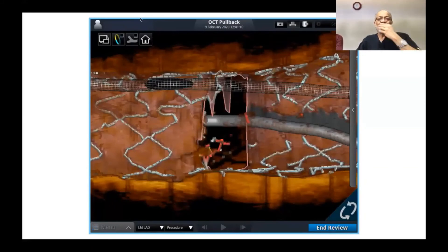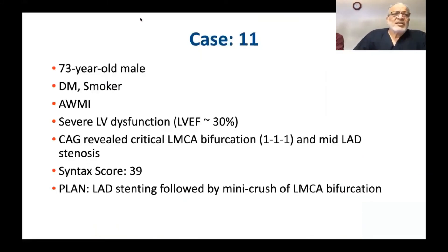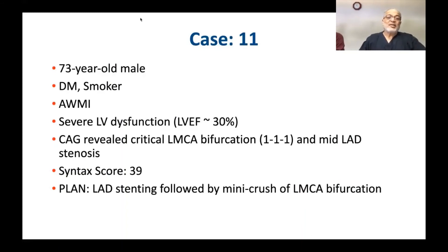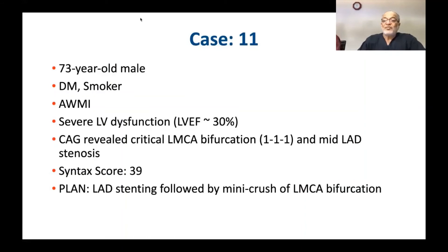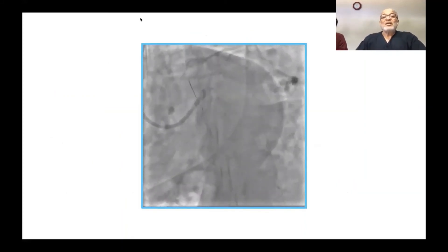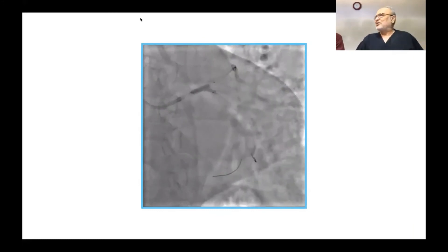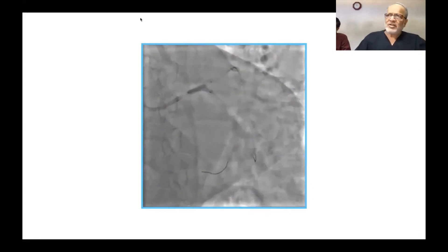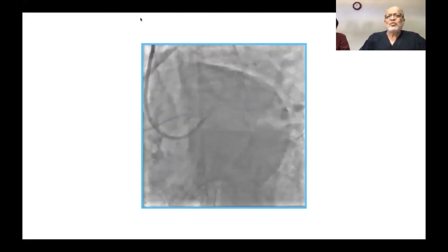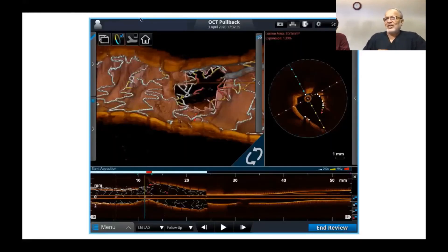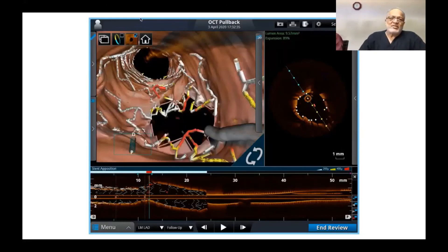A 73-year-old diabetic smoker with ongoing anterior wall MI and severe LV dysfunction, LMCA bifurcation Medina 111 plus mid-LAD stenosis, high syntax score. Plan: LAD stenting followed by mini crush of LMCA bifurcation followed by final kissing balloon. Because it was an acute MI situation with ongoing anterior wall involvement, we did not insist on distal crossing. Result was reasonably good but OCT showed link-connecting carina, proximal crossing, and good amount of crowding — acceptable in that emergency situation.